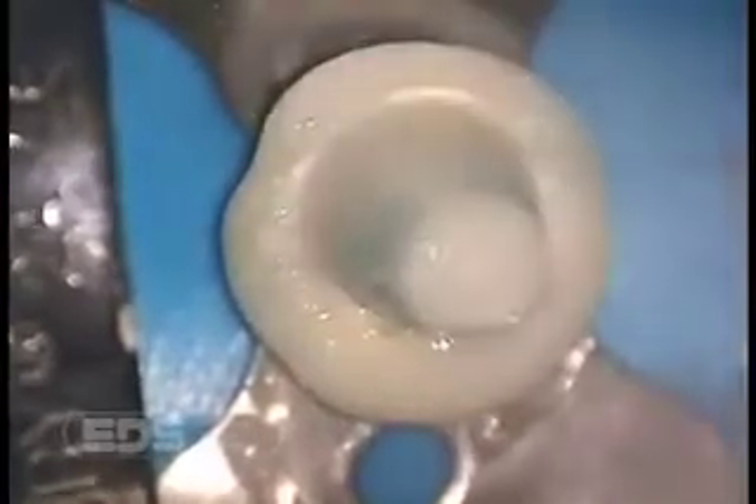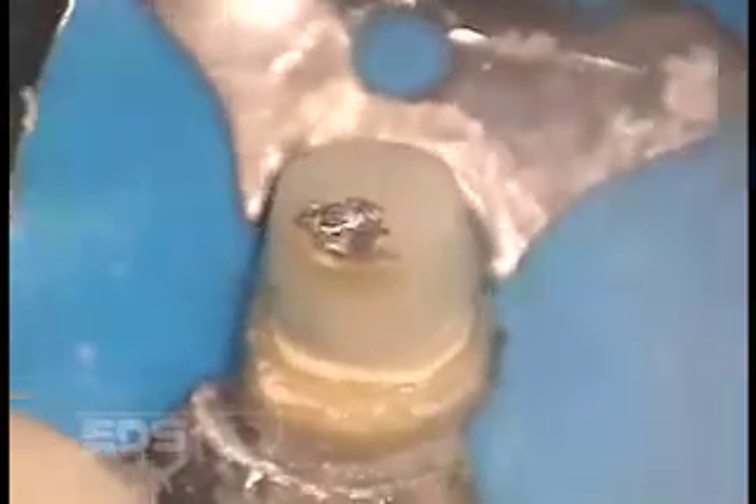It will continue to self-cure for the next six minutes. Once the core form is removed, we are ready to prepare down the core for the final crown preparation. Because Tyco is reinforced with titanium and lanthanide, the material is exceedingly hard and reduces the likelihood of ditching or grooving during core preparation. The white line between the core and the tooth structure is the bonding material. It is never a problem to expose some of the post head on the occlusal end of the preparation.